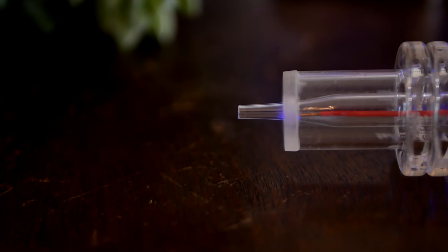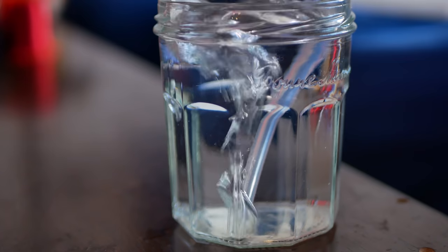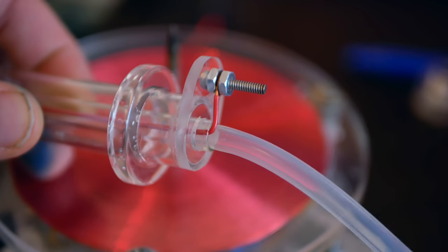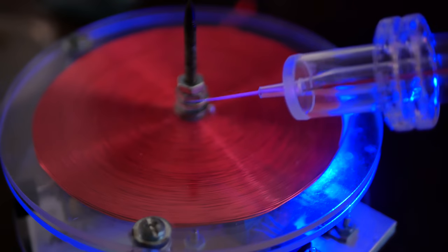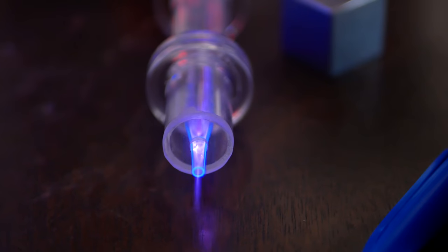This setup is classified as a microjet and produces cold plasma for a specific reason. First, helium gas is more electrically and thermally conductive than open air. For example, I can disconnect the power to the wand and keep the gas tube attached. With the slayer turned on and the gas flowing, the helium will still ionize just being within proximity to the coil. Second, ions form at the speed of light, but heating up ionized gas does take more time.